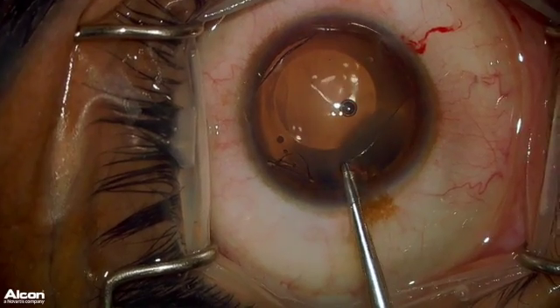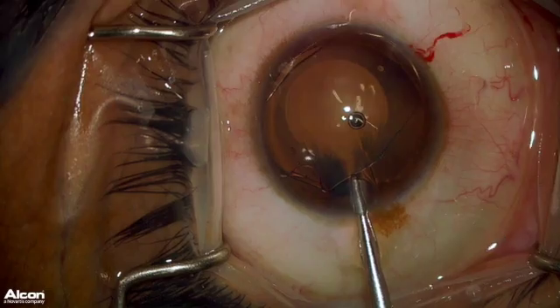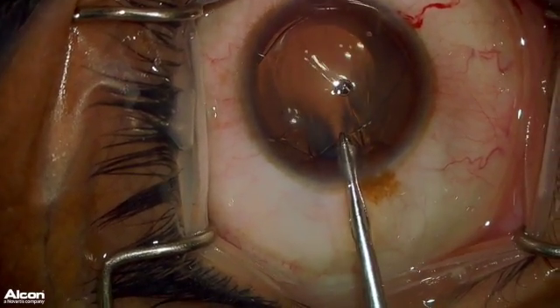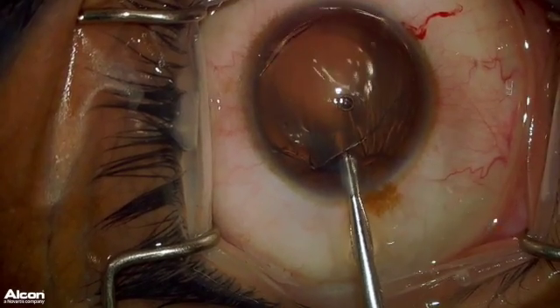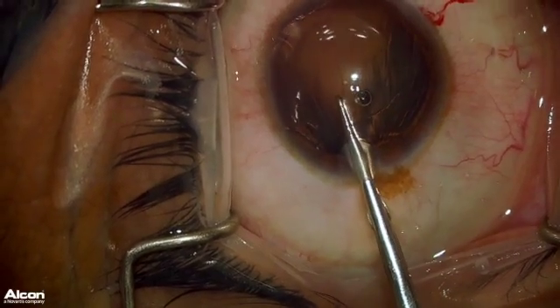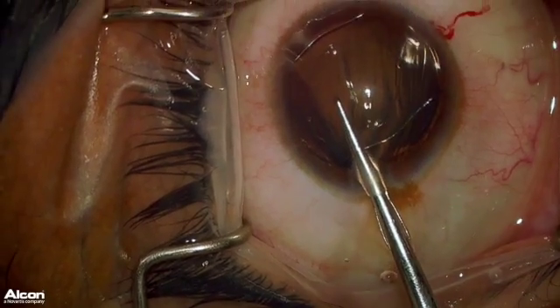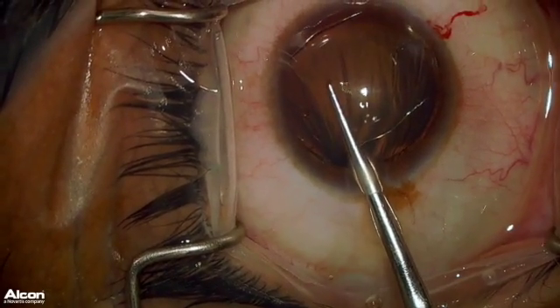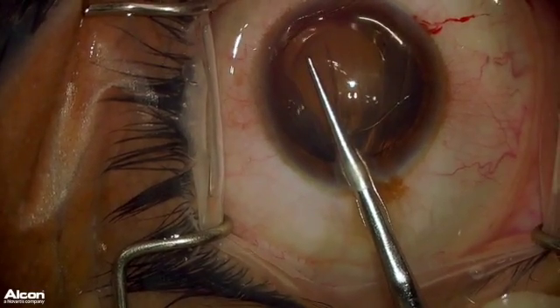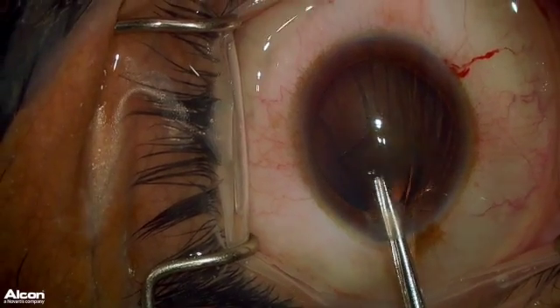Here, I am going inside the eye, being very careful not to touch the cornea or the lens. The goal is to come across about 80% of the ICL. If I do not grab enough of the ICL, it will just fall off the forceps as I try to pull it out of the eye. The whole goal is to get a good, firm grip of the ICL so I can pull it out with one fluid motion. As you can see, I am coming across the ICL along that 1/3, 2/3 junction, trying to get about 80% length of the ICL, firmly getting a hold of it, and now coming out with one fluid motion.